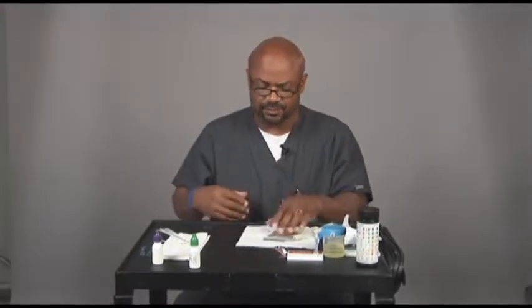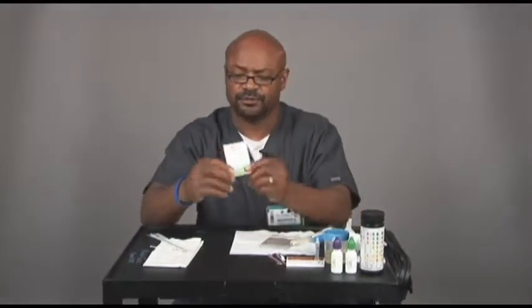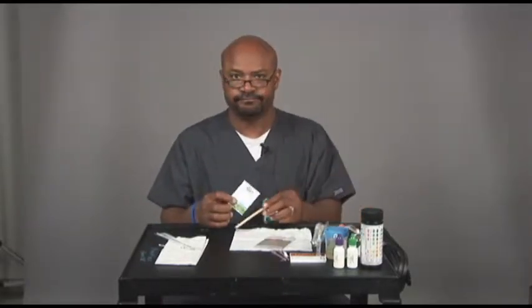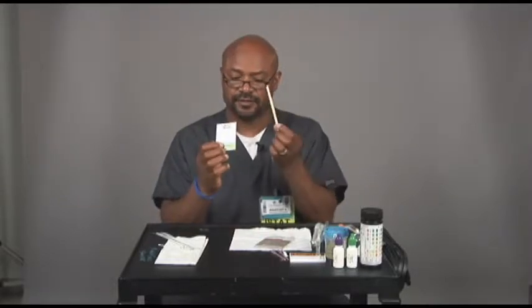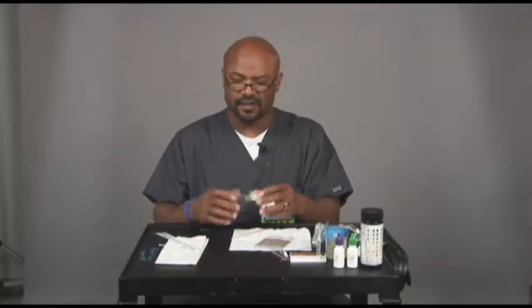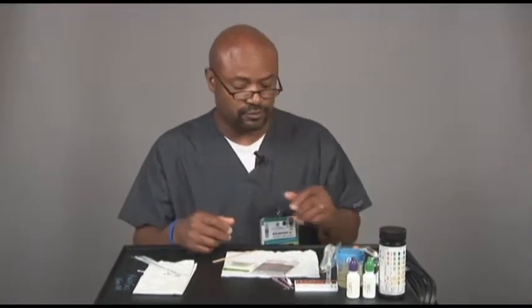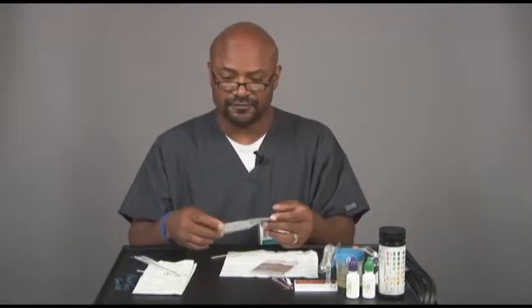A couple of our other tests that we perform are the gastrocult and hemocult. Hemocult is used for checking for blood in stool. To perform a hemocult test, you would need a hemocult slide. Of course, you need some stool for that. You need a slide, a stick. If you don't have that, normally the doctor would order that you do a rectal exam in order to obtain a smear on your gloved finger.